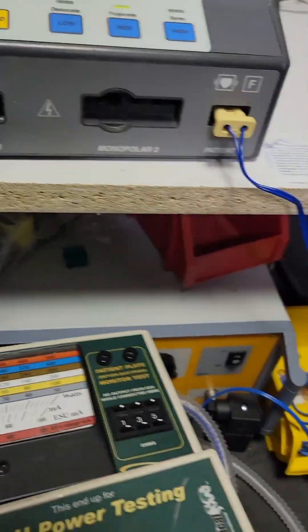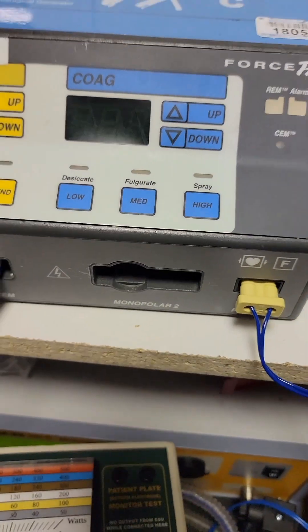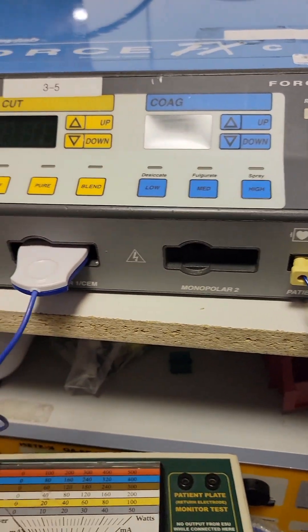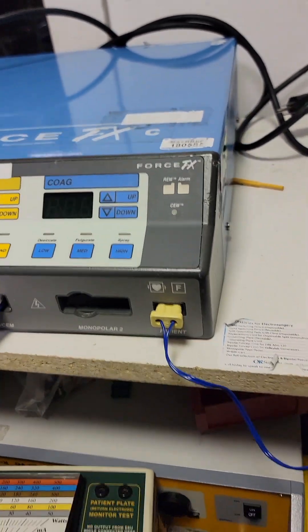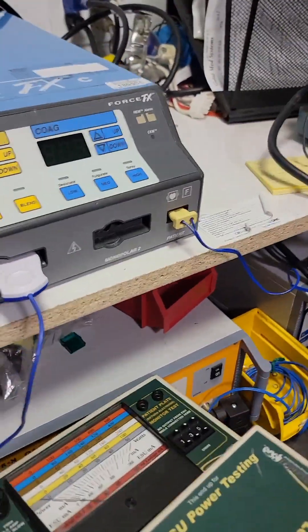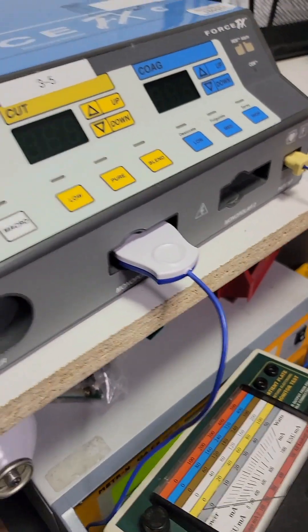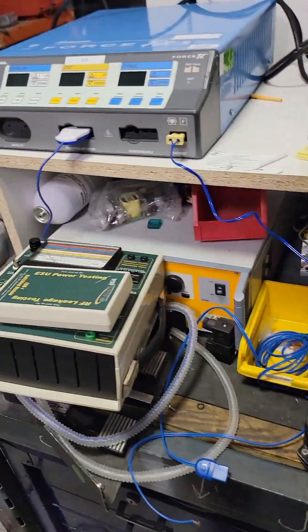That's it — you test your outputs: all three modes. And then you test your REM. Pencils and REMs are disposable, so unless you're there on a service call for an error, you're not testing the disposables. You've got to test your foot pedals and make sure they all work, check ground resistance on your plug, chassis leakage on and off — and that's it.